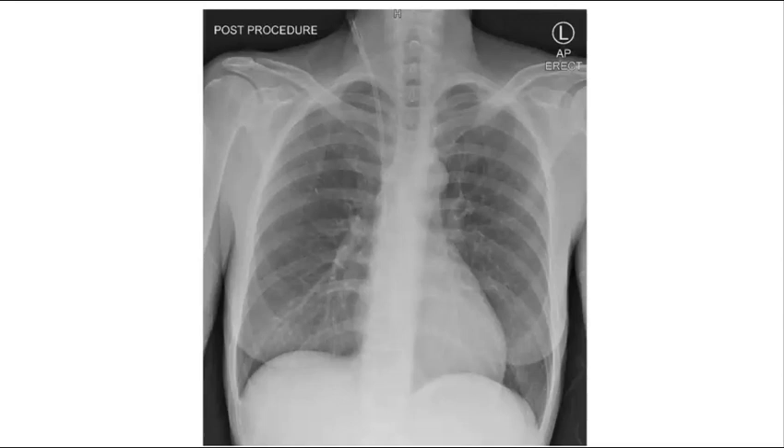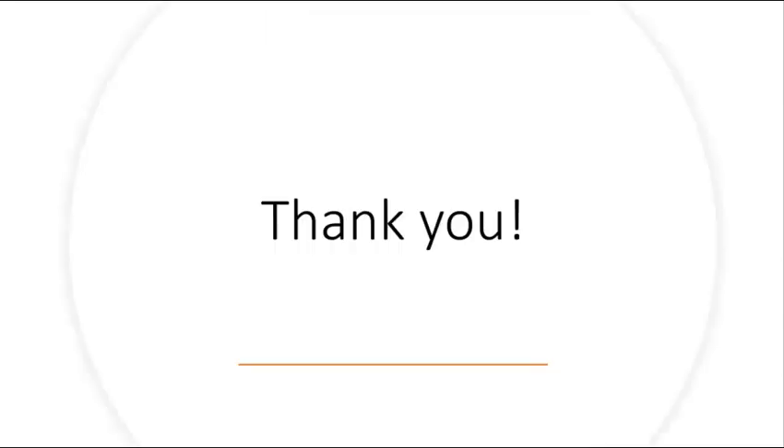The post-procedure chest x-ray will look something like this. You can see the tip of the catheter terminate in the SVC or the cavoatrial junction. If the catheter was accidentally placed in the artery, you would see it cross midline and enter the aorta on the patient's left side on the chest x-ray. Once you have confirmed correct placement with the chest x-ray, your central line is now ready to be used. Thank you so much for listening.